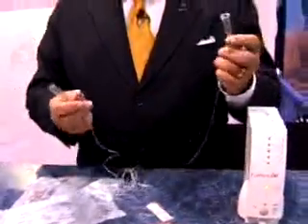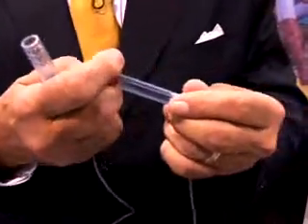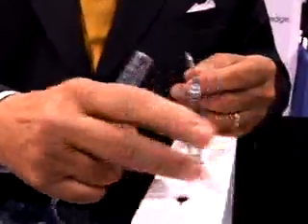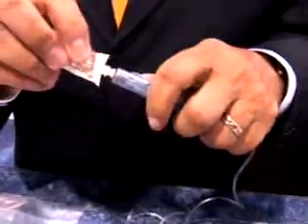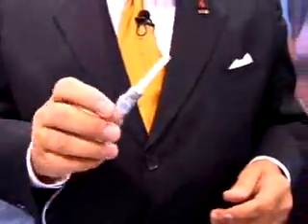The first component is the cartridge holder, which will penetrate through the membrane on the cartridge and then go on the top of the unit. It's attached to a micro tubing, which is now attached to the safety wand. The safety wand will use a luer lock needle, which will be put onto the safety wand as so, and will fit on top of the unit.